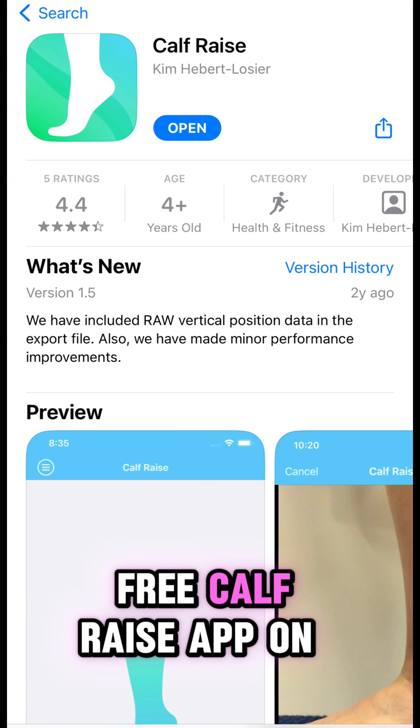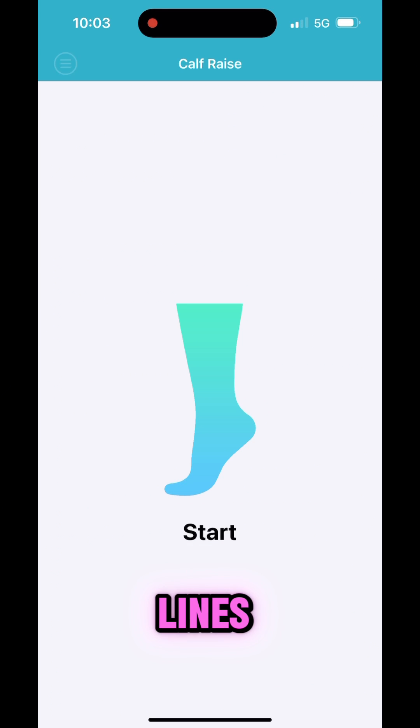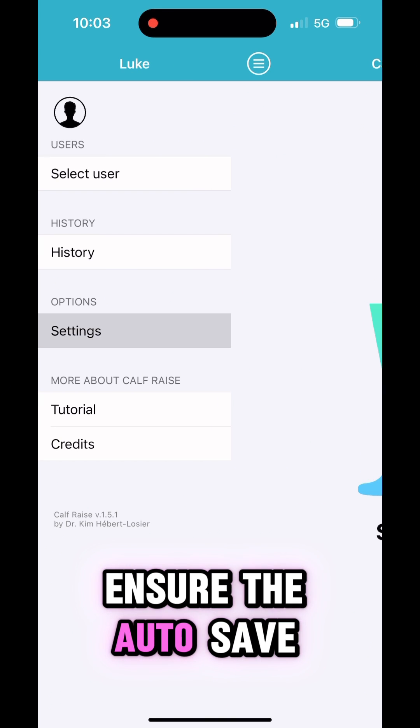Firstly, download the free calf raise app on either the iPhone or Android. Open the app, click the top left three lines, then click settings and ensure the autosave function is on.